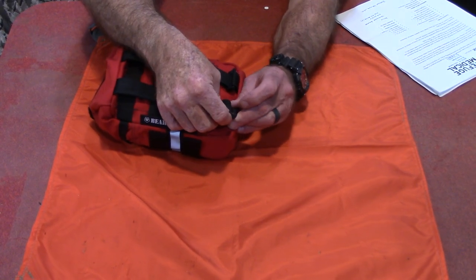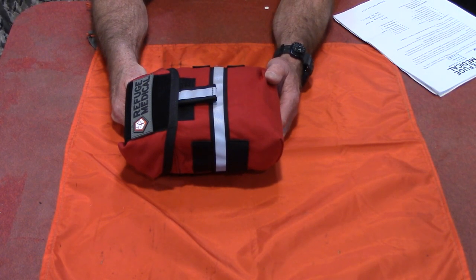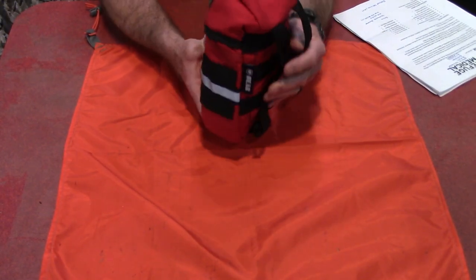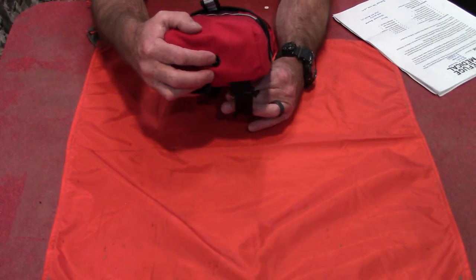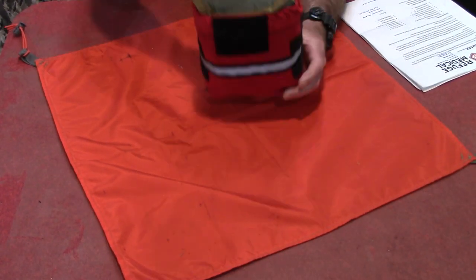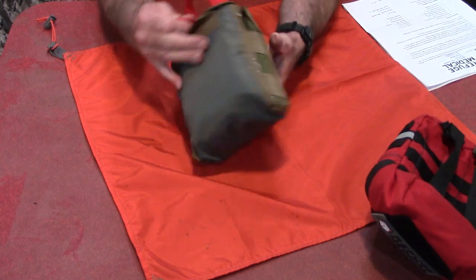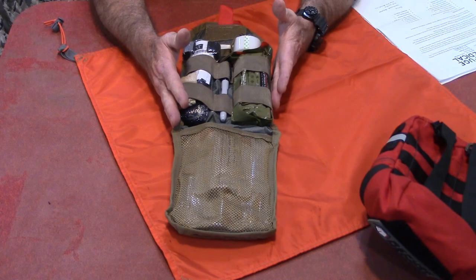This is the outer cover — you can mount it on any MOLLE field and it has a drain hole in the bottom. Inside, you pull out the inner pouch, and that's where everything is organized. Everything is in its place and a place for everything. Everything is organized so you can get to it in low light or no light conditions once you learn where it is — and you do need to learn where the stuff is.